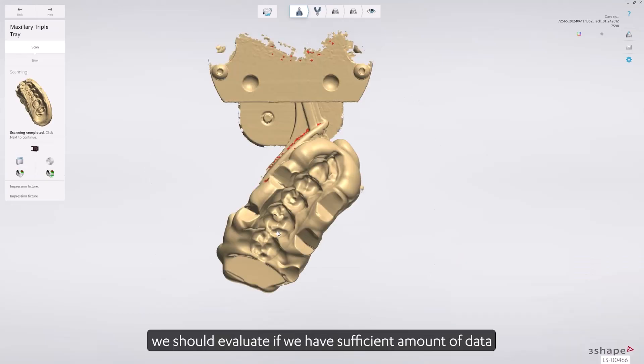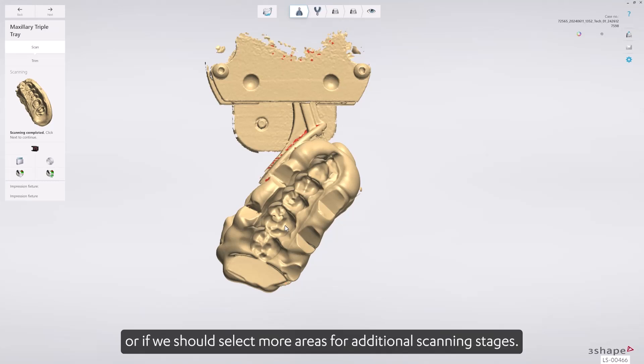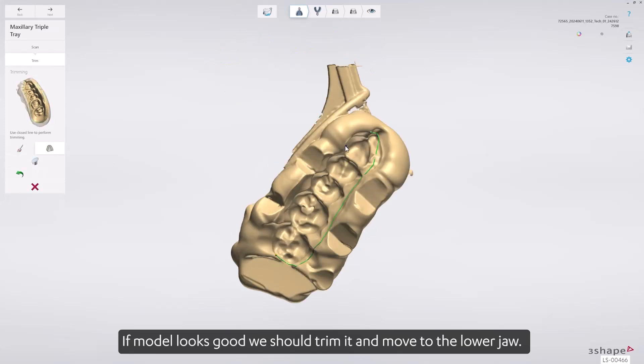After the model is completed, we should evaluate if we have a sufficient amount of data or if we should select more areas for additional scanning stages. If the model looks good, we should trim it and move to the lower jaw.